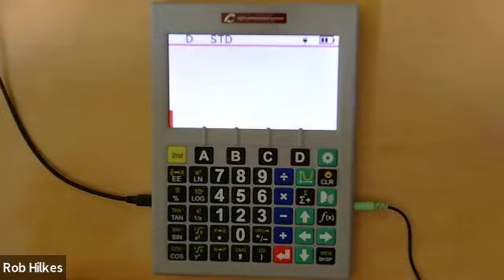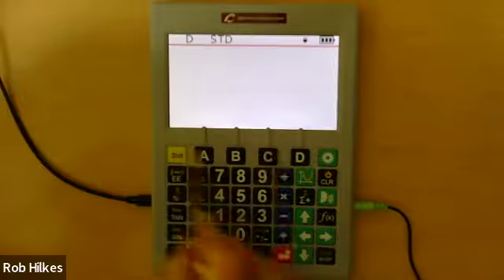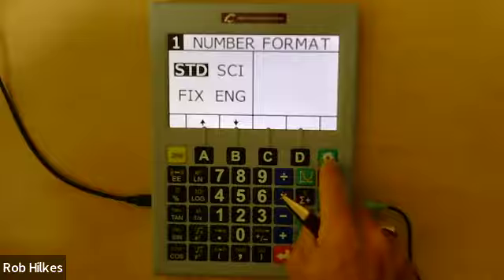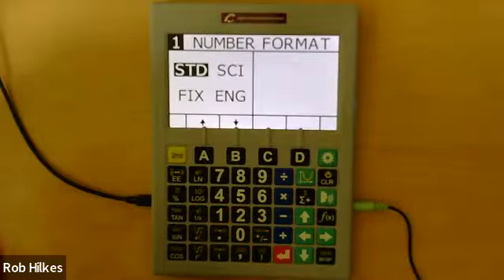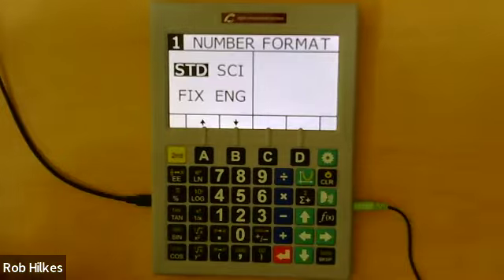So I'm going to go ahead and turn it on, and you'll hear a beep from the speakers here. And what you can see right away is the calculator display. And I'll just walk you through some of that. Now, that's going to be annoying, so I'm going to turn the speaker off. I just proved to you that there's a speaker. But we'd like to not have that interrupt our webinar so much.